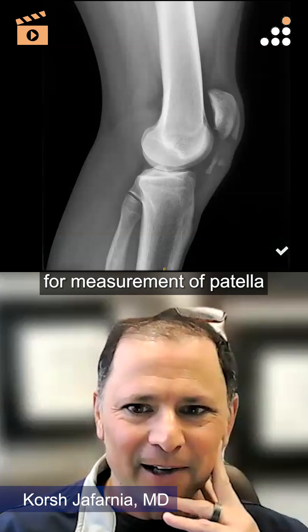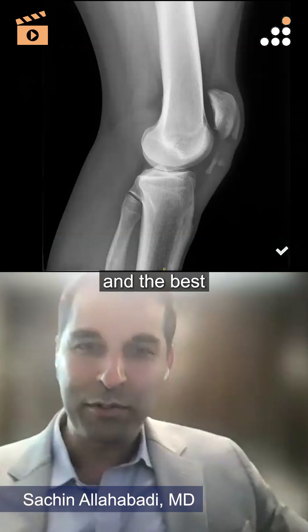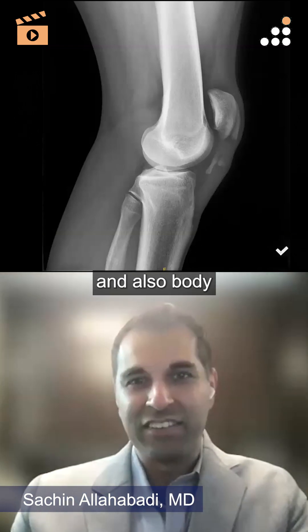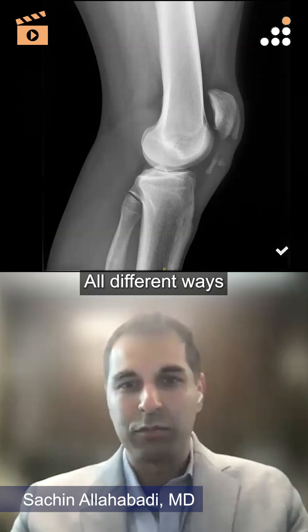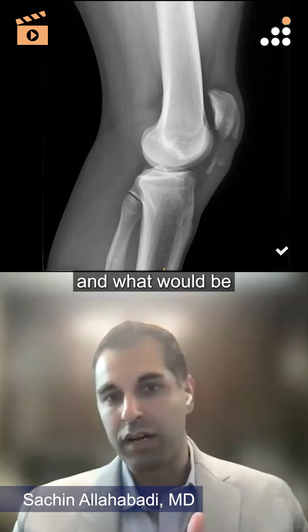There are lots of ratios, and the best part is they all have fancy names behind them. There's the Insall-Salvati ratio, the Caton-Deschamps ratio, and the Blackburne-Peel ratio — all different ways essentially to measure what a normal patellar position is height-wise, what would be considered baja or too low, or alta and too high.